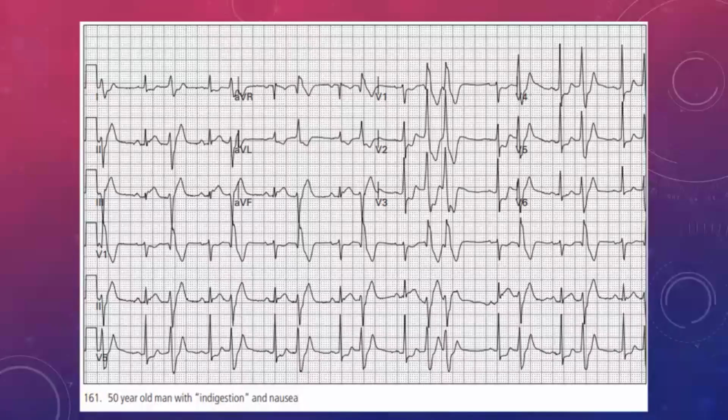But the one thing that we've got to think about now, what do you think would happen if the heart was unable to keep this up? In other words, if the infarction gets worse? Because you already know the diagnosis, you already know what's going to happen, you've already started your treatment. Now we're actually going to a point where we're trying to say, okay, now I've got to prepare myself for what could go wrong. So what do you think could go wrong in this patient? Any ideas? I'll give you a minute to think about it. So just so that you now sitting in your emergency department can say, okay, what do I need to have ready? Because there's a possibility that some things may happen.